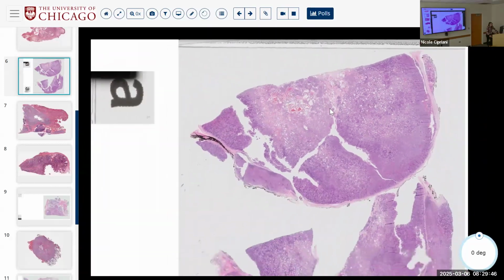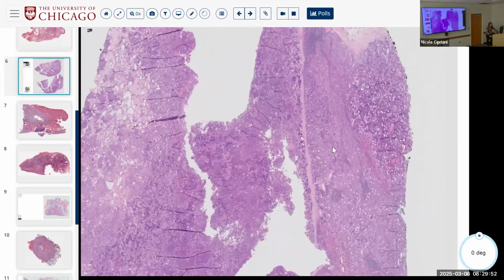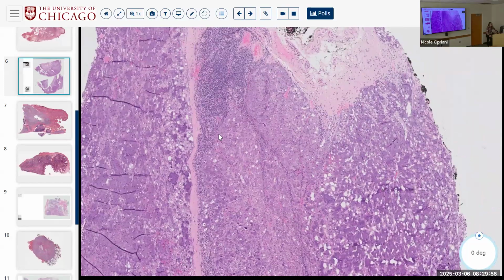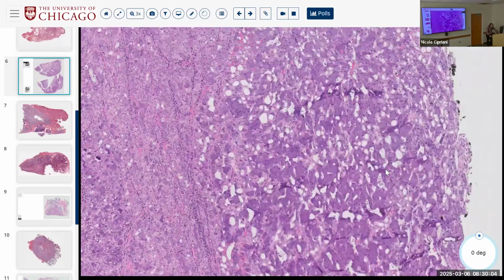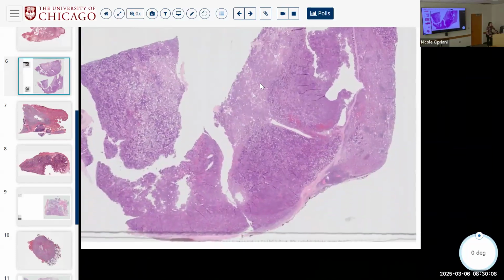What was I gonna say? Oh, the thing with the acinic cell is that it can be very circumscribed, but we still regard it as a malignancy. In this case, there's perhaps some infiltrative looking growth, as pointed out, beyond the capsule and perhaps into or adjacent to the normal gland. Although this all still looks like tumor, so I don't know. Who knows? This may just be a tangential section, whatever.